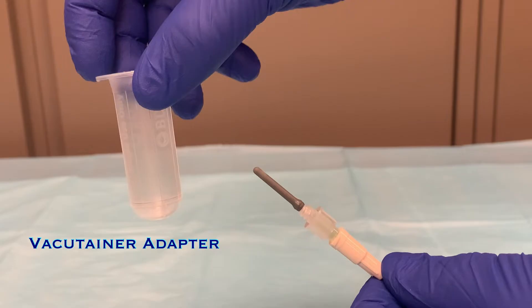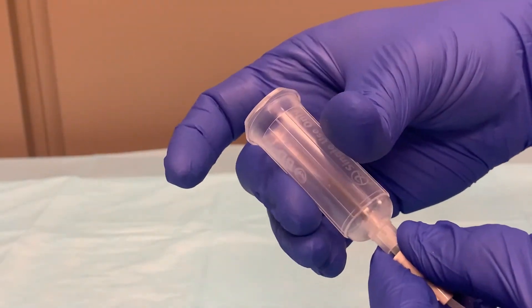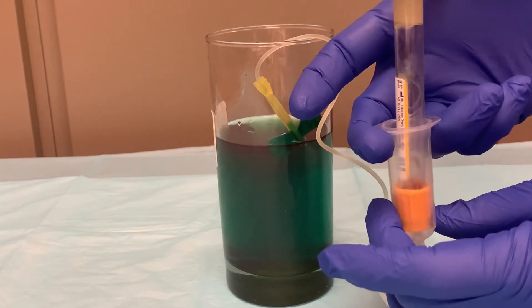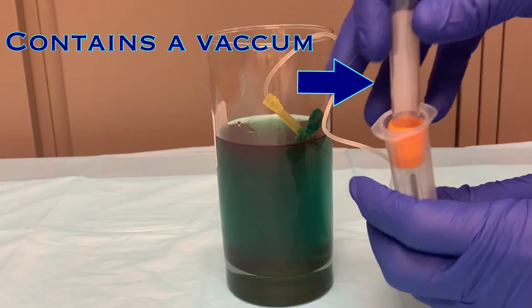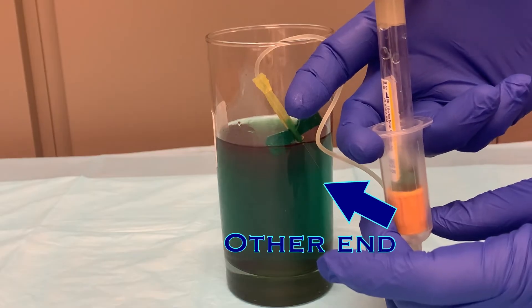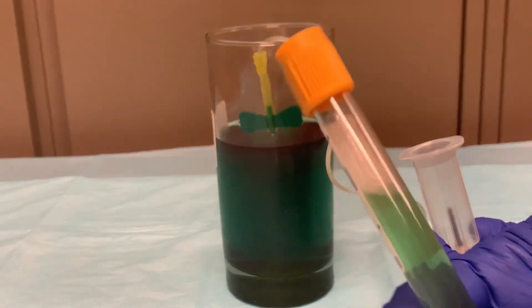The vacutainer adapter and vacutainer tubes are used along with the butterfly. To make this possible, attach the vacutainer adapter to the end of the tubing by screwing it on. Now vacutainer tubes can be placed in the adapter and pushed onto the needle to activate the vacuum in order to fill the tubes with blood. All vacutainers are negatively pressurized to fill with the desired amount of blood, meaning each tube contains a vacuum. When a needle pierces the cap of the tube, it will pull whatever is on the other end of that needle to fill that vacuum. When the butterfly needle is in a vein, the blood will fill the empty tube.